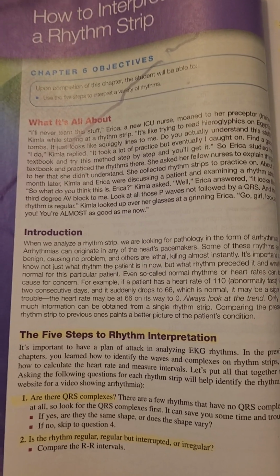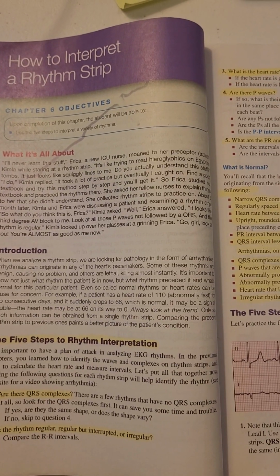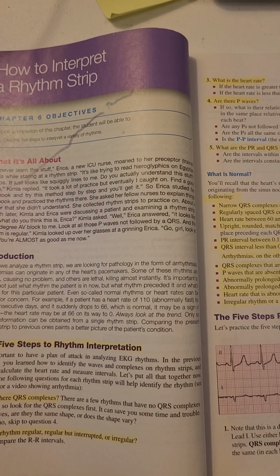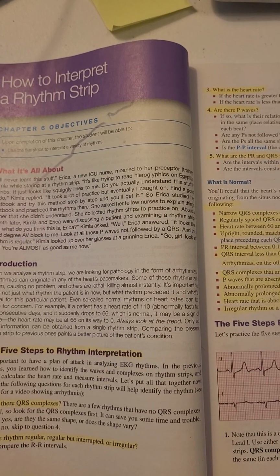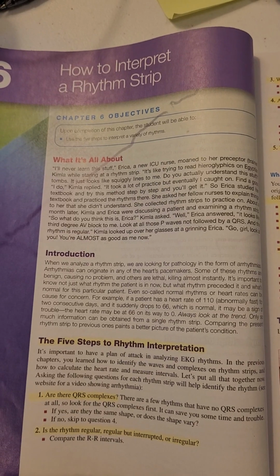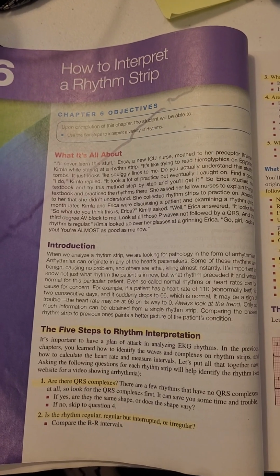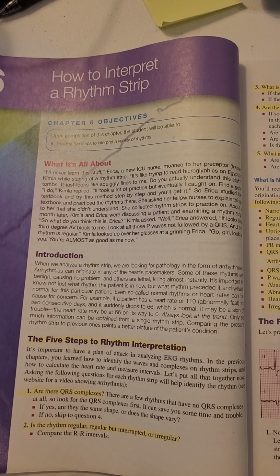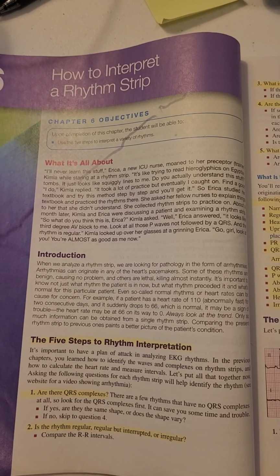So just to read the introduction, it says when we analyze the rhythm strip, we are looking for pathology in the form of arrhythmias. Arrhythmias can originate in any of the heart's pacemakers. Remember that pacemakers are the sinus node, the AV junction, and then if the impulse starts in the ventricles, that's when it gets dangerous. But the sinus node is a healthy one. Some of these rhythms are benign, causing no problem, and others are lethal, killing almost instantly.